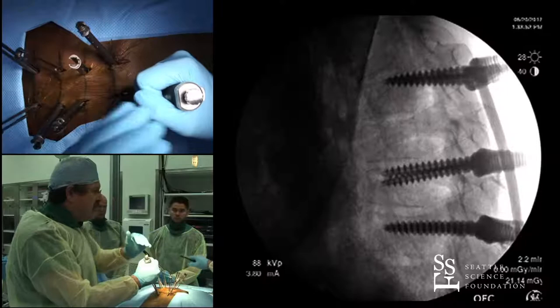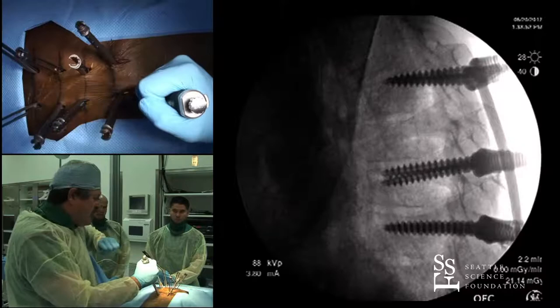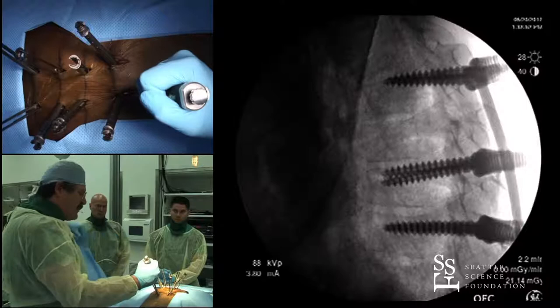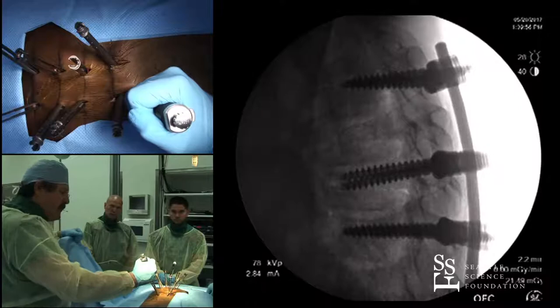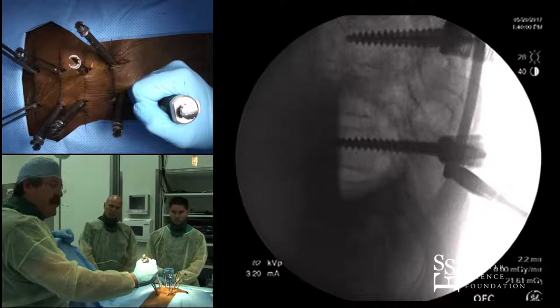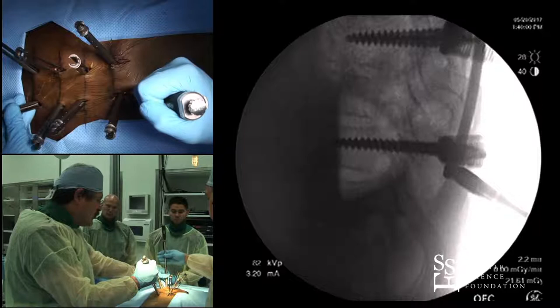I'll drop my rod in all the way. You want to make sure the rod, as you put it in, is deep to the fascia — if it's not, the fascia will pucker and pull down into the wound, making closure much more difficult. Once I think I'm all the way through at the top, I'll verify and give it a little more room. I'll check the bottom too. As it squeezes down there'll be more room for the rod. My contour is going to be pretty good, so I'll start squeezing the rod down.